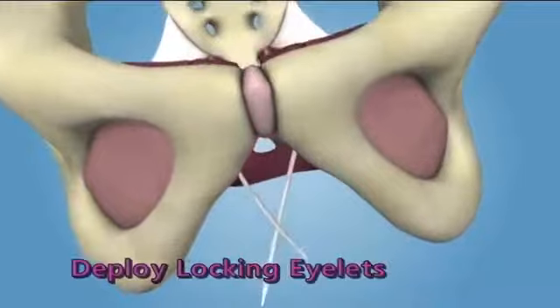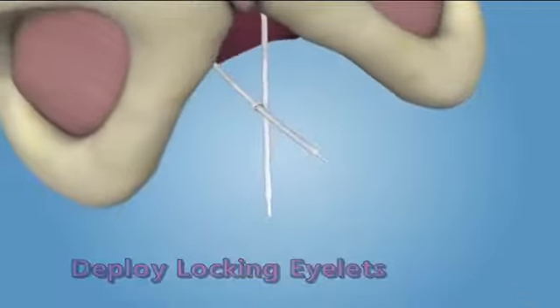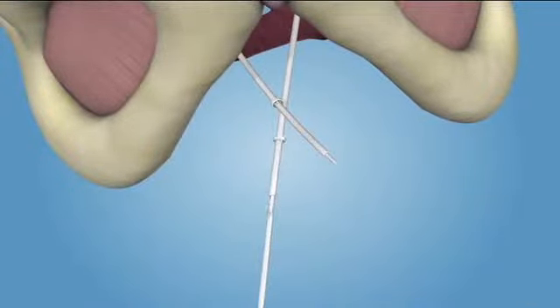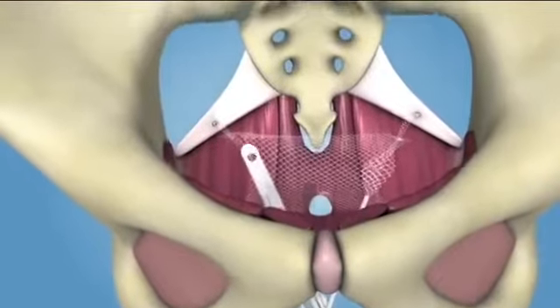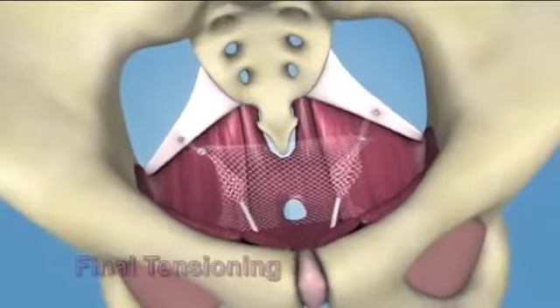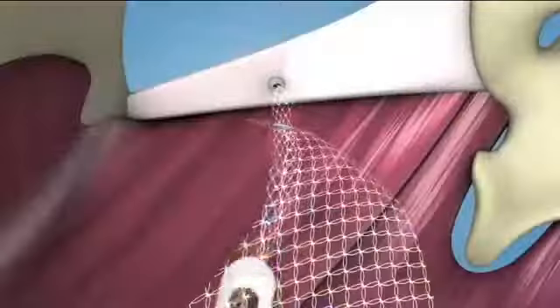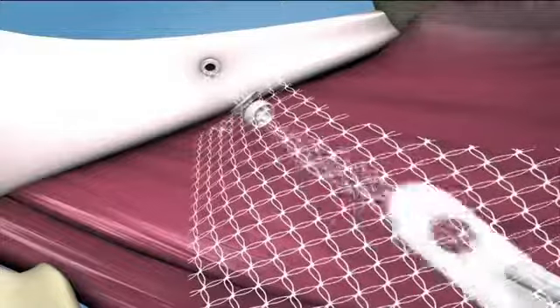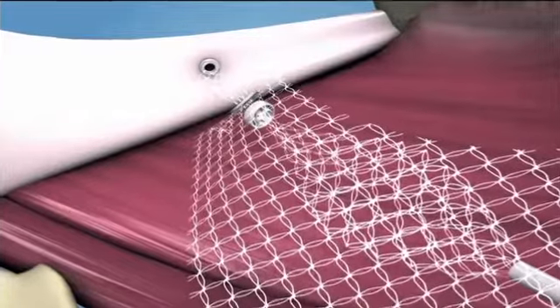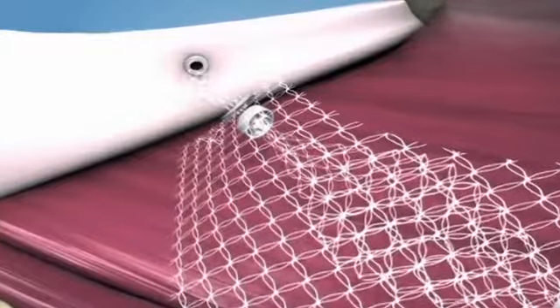Deploying the locking eyelets. Once final graft placement has been achieved, attach the female end of the eyelet applicator into the end of each fixation arm. Slide one locking eyelet onto the fixation arms at least 2 centimeters and disengage the applicator. Using the adjustment tool and alternating sides throughout the process, slide the locking eyelets down the fixation arms into the pelvic cavity while maintaining medial positioning within introitus. Continue advancing the locking eyelets down the apical fixation arms until they reach the graft, and palpate to verify the locking eyelets rest against the surface of the graft.